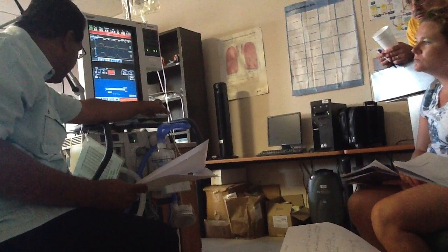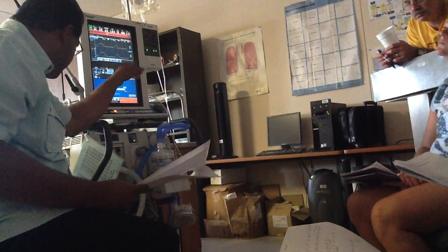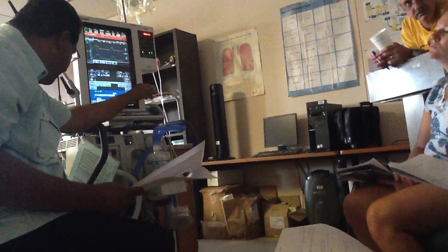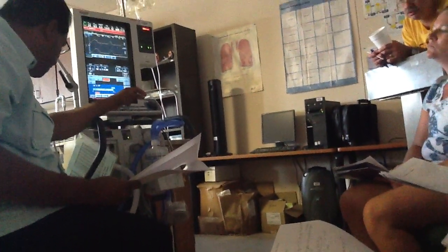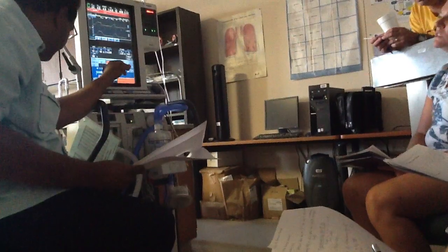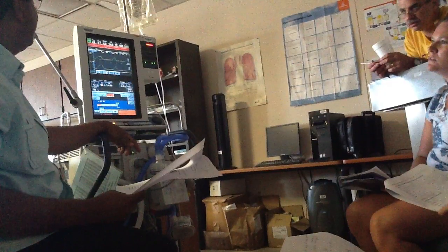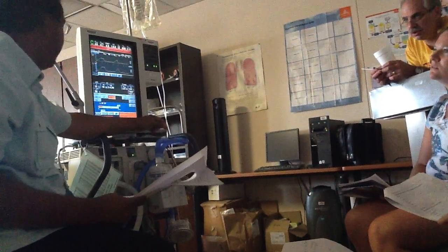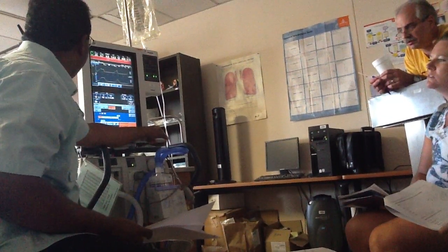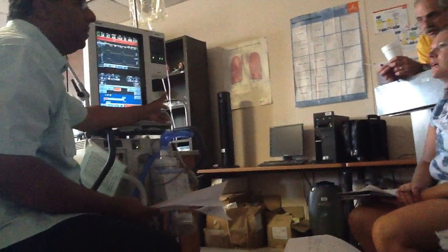So when I change it to 1 to 1, what am I doing to the TI? Let me show you. You'd be decreasing TE and increasing TI, right? What am I going to do to the TI to keep that IE ratio 1 to 4? Keep it the same. If you still wanted that 1 to 4, you keep it the same.